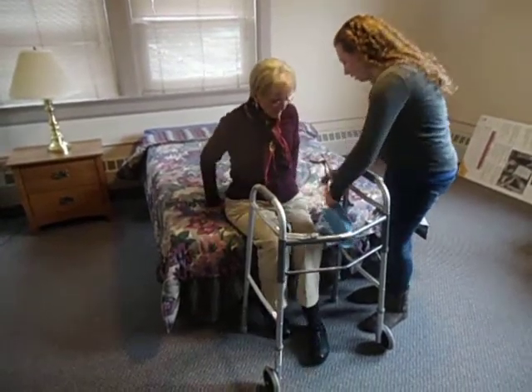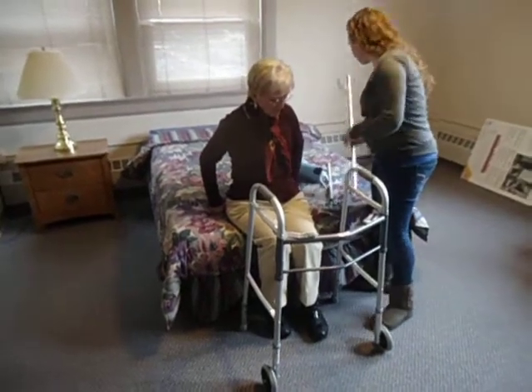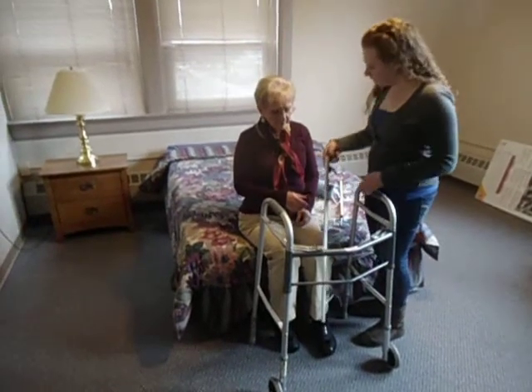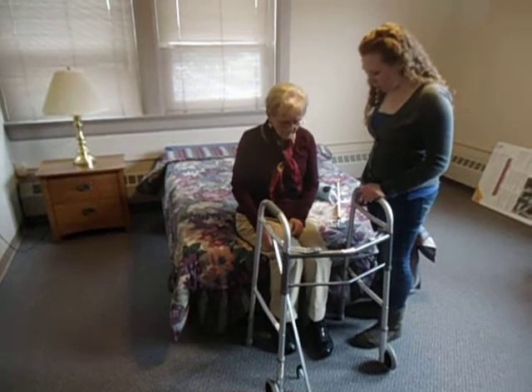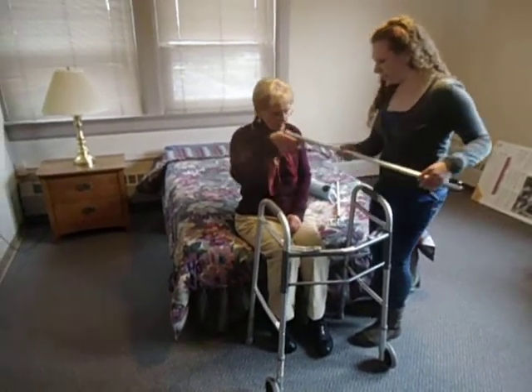And now these are other adaptive equipment. Another useful piece is the reacher. So this will help you to avoid bending down and adhering to the hip precautions. Perfect. Okay. Great.